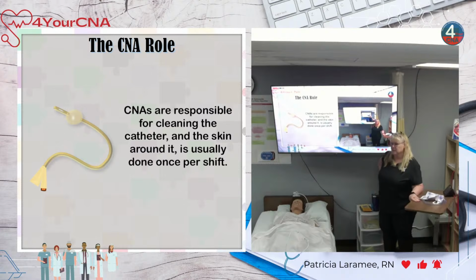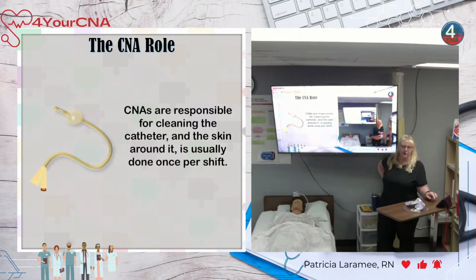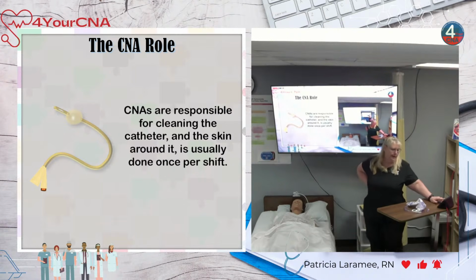CNAs are responsible for cleaning the catheter. We keep the catheter clean, we keep the skin around it clean, and we empty the drainage bags. That's our responsibility with the catheter, and to report anything we see, hear, smell, or feel that's kind of funky, right?